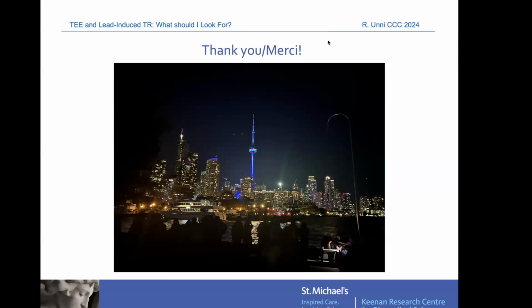Wonderful. Any questions or comments or experience from our sonographer colleagues? Do you find it challenging to image the lead? Should we be doing more TEEs for these patients, given options that are available now? So the question from our cardiology resident colleagues is, should we do more TEEs on patients with lead-related or lead in association with tricuspid regurgitation? I'll let you answer that first.